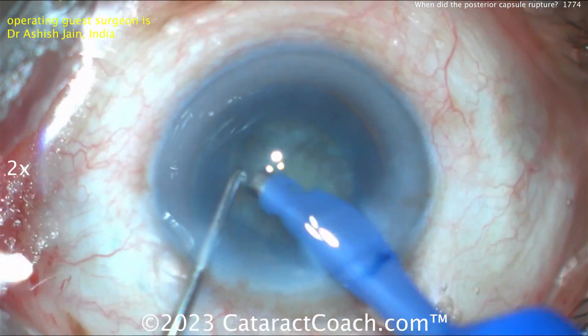Last quadrant chopped again, sub-chopped, aspirate, a little phaco, a little ultrasound — take it down. Capsule looks okay. Let me look carefully. So far so good, and now — whoa, what's happening? These last little pieces that are left look like some epinuclear shell. Bring that up, that looks okay. Still looking okay — where is the capsule break, when's it going to happen? Last little piece comes up, chopper mashing it into the probe. Last tiny piece of epinuclear shell, and still looks okay.